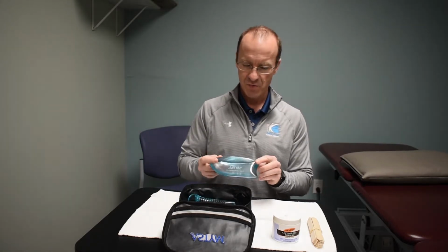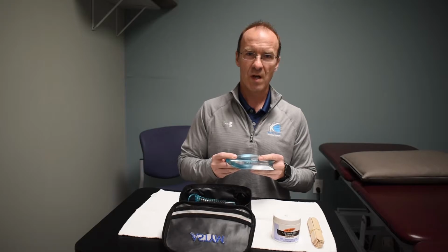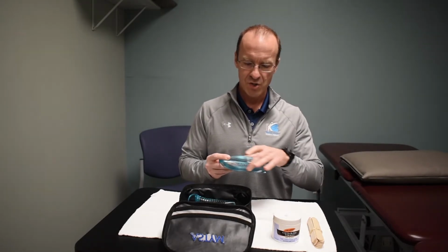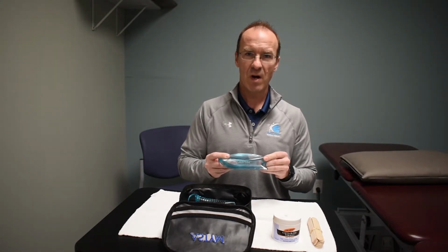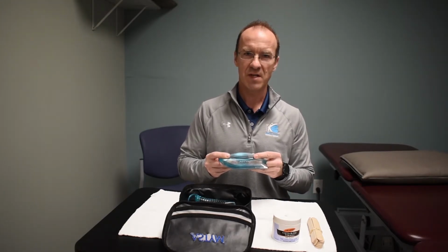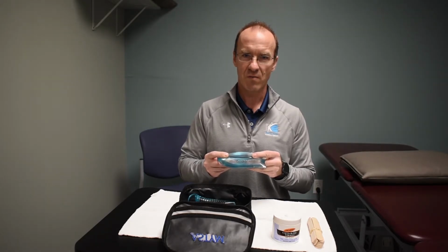The first tool that we have is what's called the Evaluator. And so part of Astym is that we're going to have different tools that allow me to not only analyze and evaluate your tissue quality, but also to affect some type of change on it so that your body does start to make the changes to improve your symptoms. So the Evaluator is a broader shaped tool that we use primarily to introduce the concept of a soft tissue massage to your body. So I'll be using the same pressure, but it won't go nearly as deep as some of the next tools that we'll introduce.